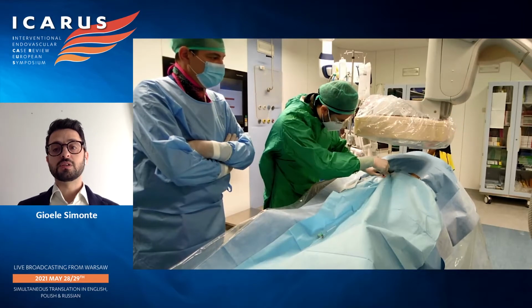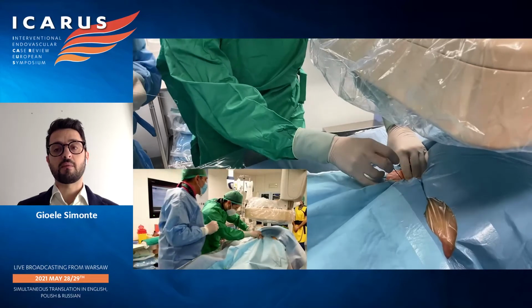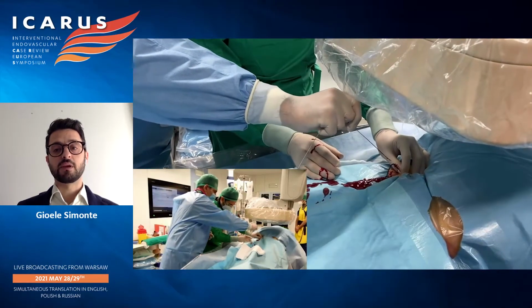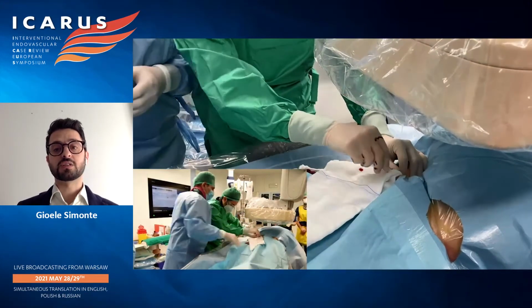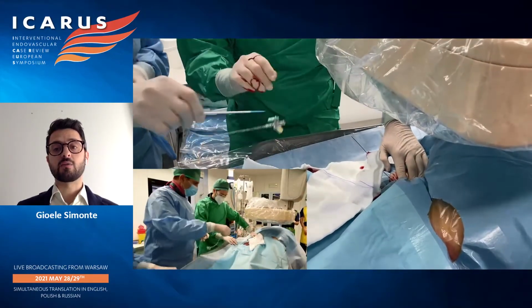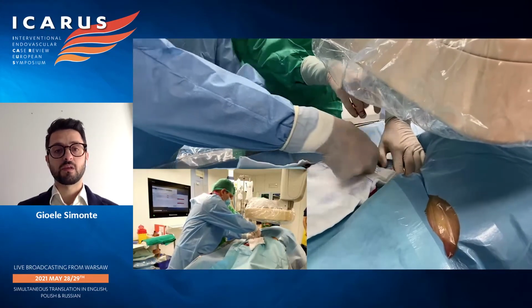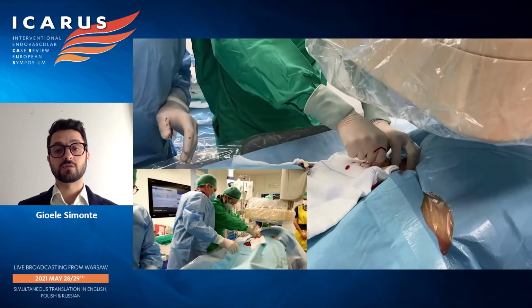So we begin the procedure performing local anesthesia right on the operative table, feeling the common femoral artery pulse and using a 2% mepivacaine solution. After waiting a couple of minutes, direct puncture of the common femoral artery is obtained, checking the entry site high under fluoroscopy. Using a standard Seldinger technique, a guide wire is advanced into the needle, and a short 8 French introducer sheath is positioned at the access site. You see here the advancement of the 8 French introducer sheath in the right patient's groin.